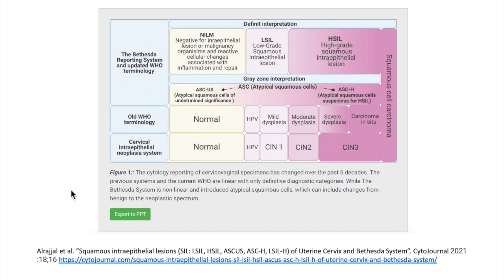Thus, the goal of this presentation is to show that Shape Genie can quantify precise steps in these gradients, and that it provides the potential to derive an objective and quantitative staging system that can discover unknown subtypes in a way that unifies all three systems into one objective and refined system.